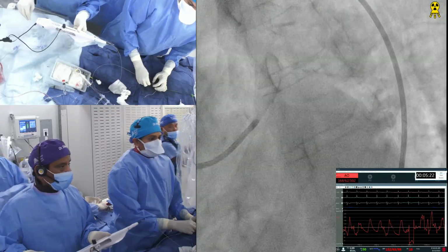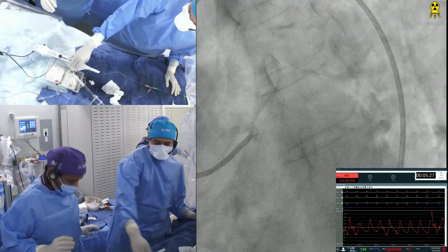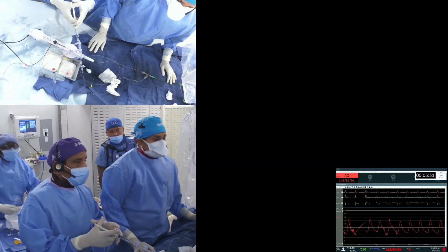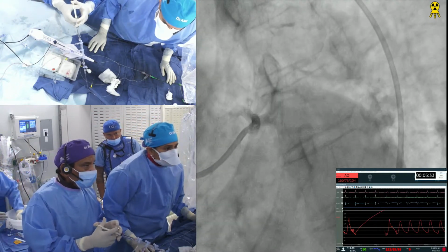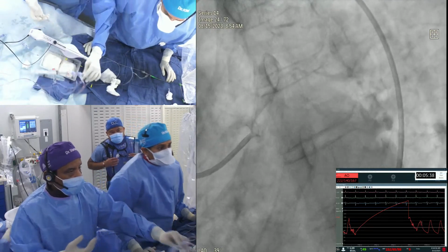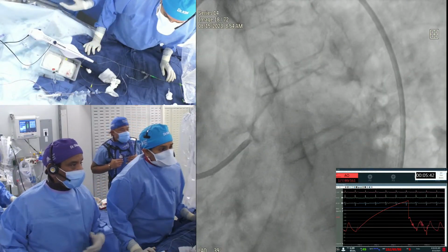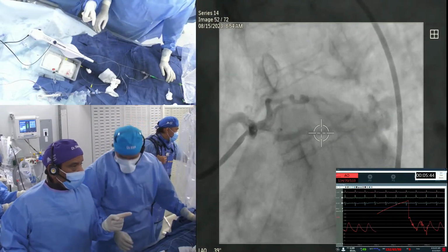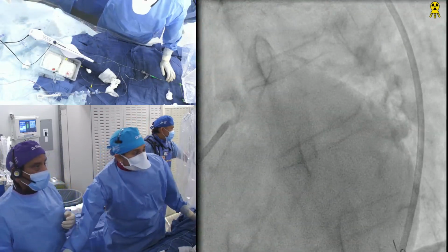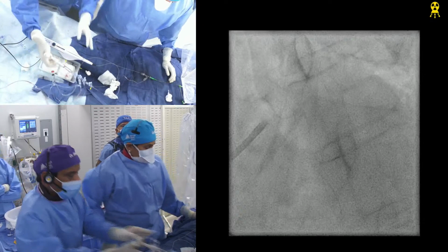Now, can I take a cine to see how the wire is? You want to take a picture or no? Okay. Yeah, but then inject. First dry. Dry. Yeah. Go now. You see it. Yeah. No, very clear. Are you able to appreciate the wire bias already? You want to go to more magnification if you want. Yeah. Now we have fluoro, just go again. We go more magnification. Okay. And then close them. Yeah. And then we'll do a cine. One more cine. Yep. Okay.